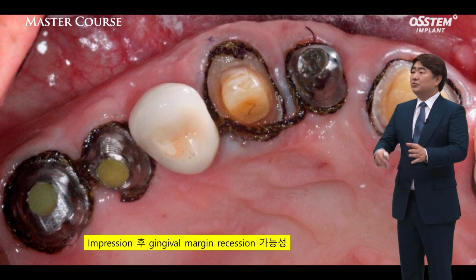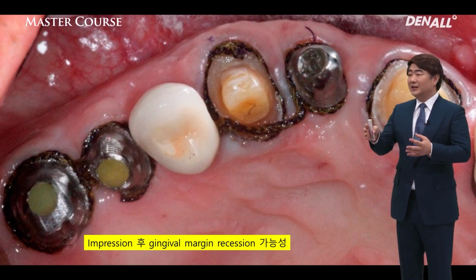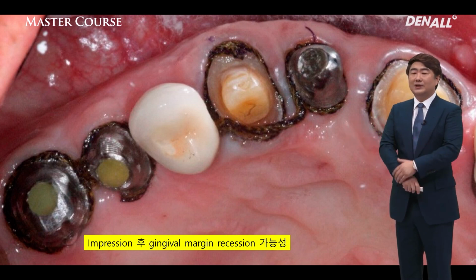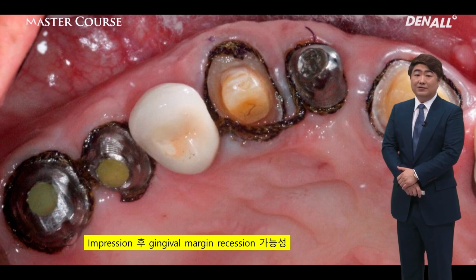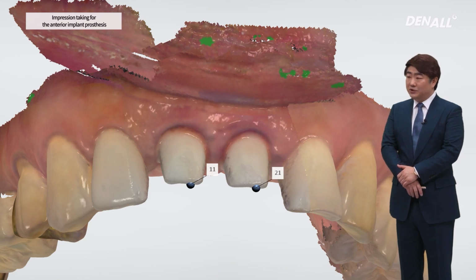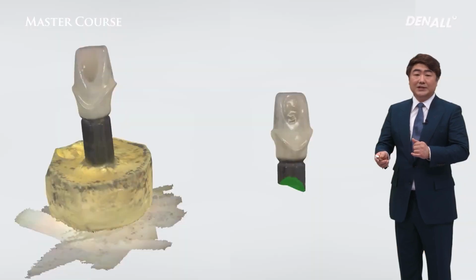For the margin area to have a good finish, if you put in cord, then again it can impact the gingiva shape. So if possible, at the abutment level, rather than impression taking, I think scan can deliver more favorable results.